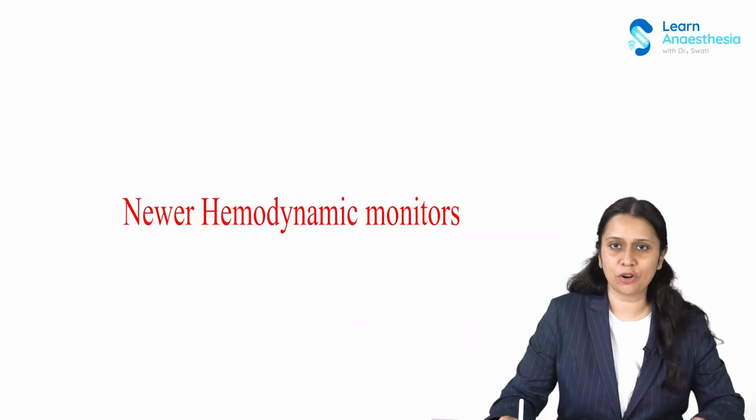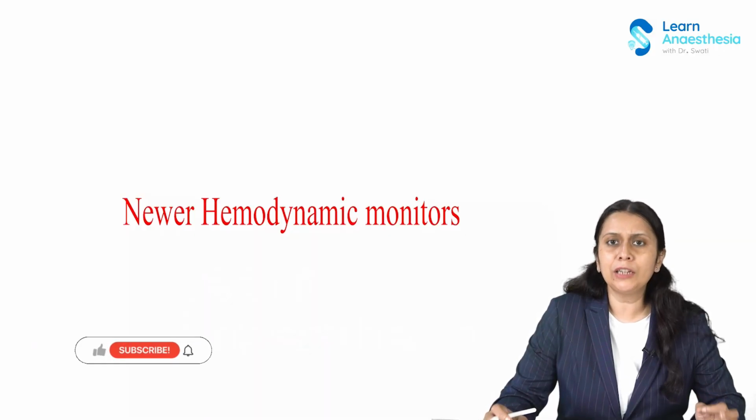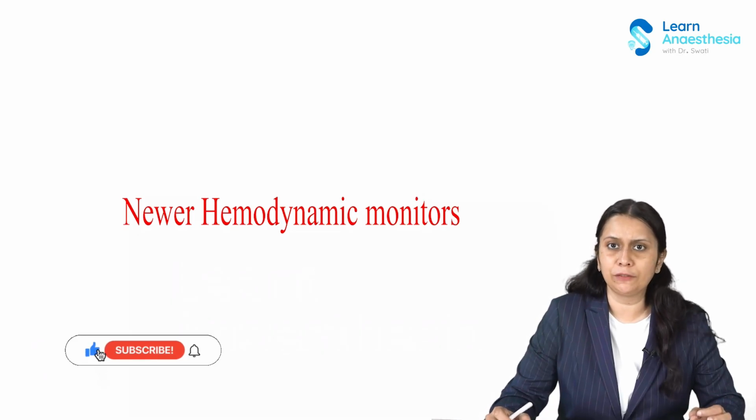Patient presenting with shock requires fluid resuscitation, but evidence-based medicine has shown us the ill effect of overzealous fluid administration. Knowing the ill effect of giving a lot of fluids to the patient has brought the concept of goal-directed fluid therapy. So what are the hemodynamic monitors which would help us in giving this goal-directed fluid therapy?